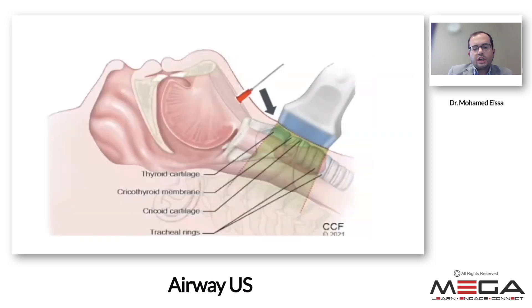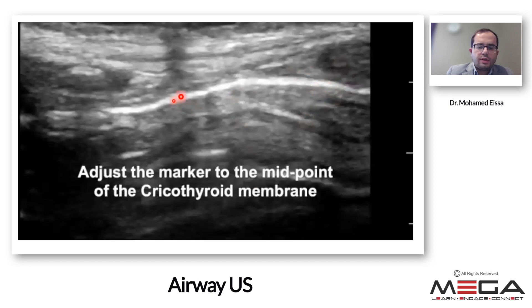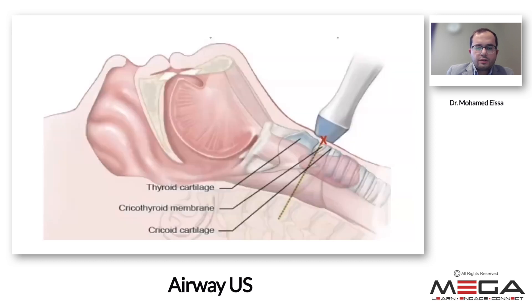For marking the cricothyroid membrane, you can slide a hyperechoic marker — such as a needle — between the transducer and the patient's skin. In the longitudinal approach you can see the cricoid cartilage, thyroid cartilage, the hyperechoic air-mucosal interface of the cricothyroid membrane, and the marker being positioned. Once you reach that point, mark the spot. You have now successfully identified and marked the cricothyroid membrane, which is essential for emergency cricothyroidotomy when all other non-surgical approaches to difficult intubation and ventilation have failed.